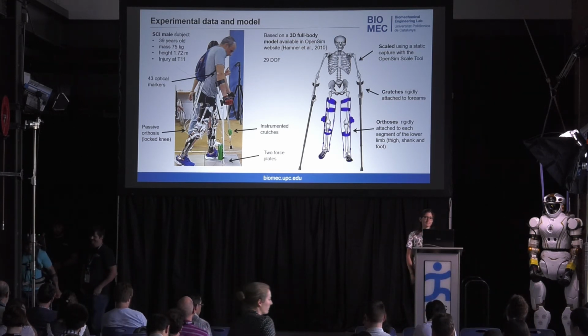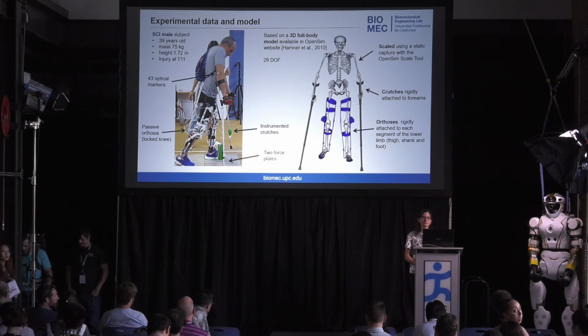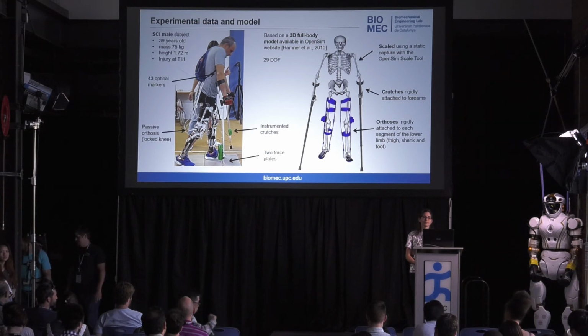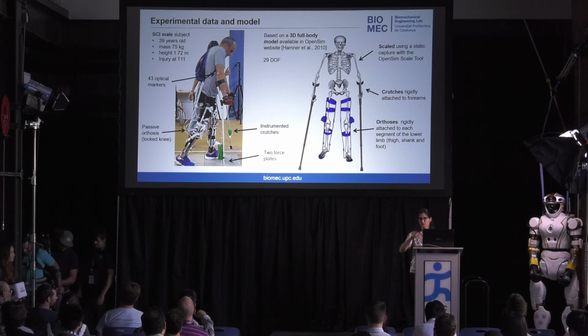You said the motor keeps the knee locked. Do you mean there is a clutch and the motor actuates the clutch, so the knee is locked, or the motor generates a torque opposite to knee flexion, so the knee remains locked? Okay, no. It's locked with the clutch during stance, and then during swing it actuates the knee.